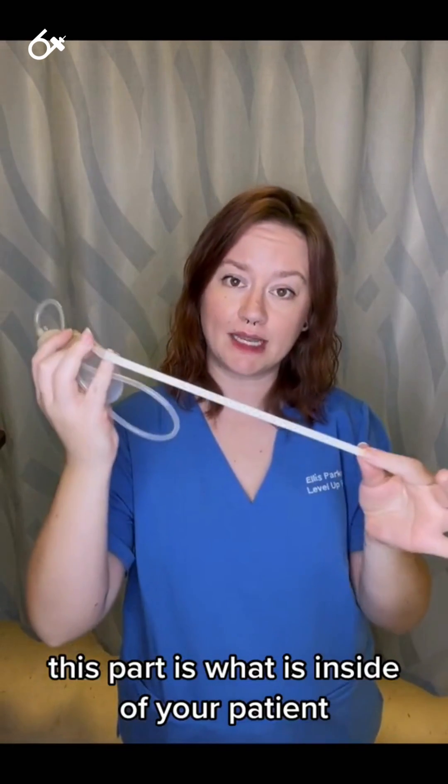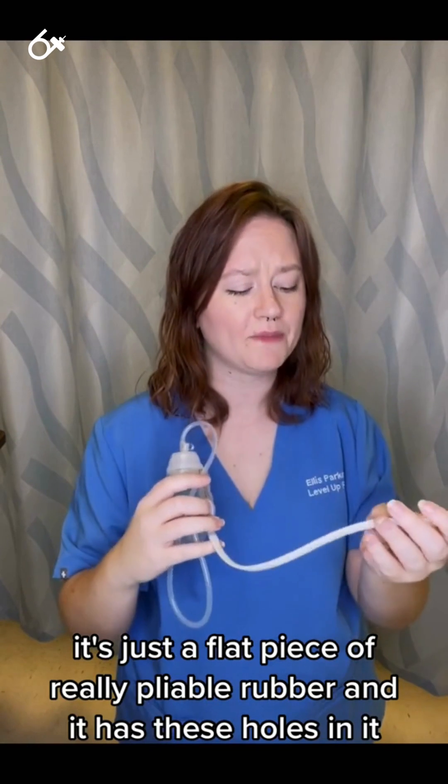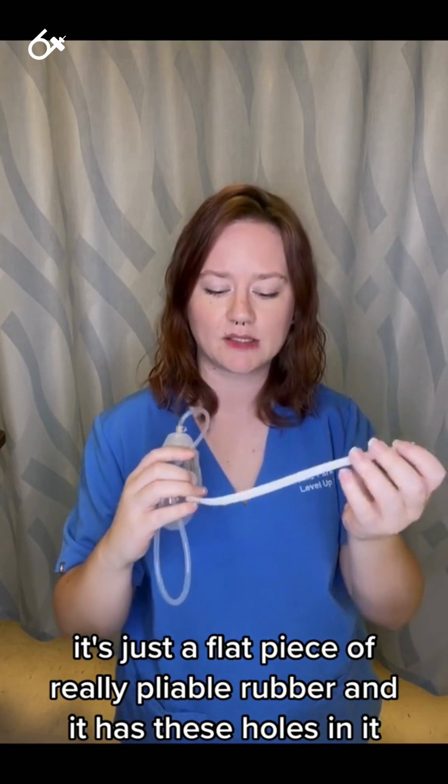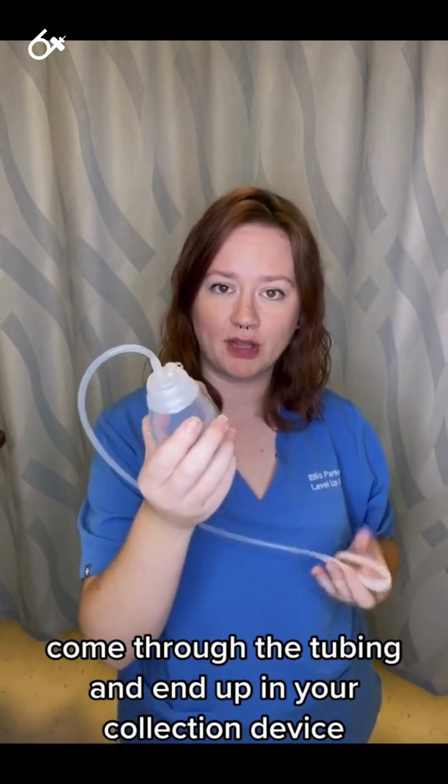This part is what is inside of your patient. It's just a flat piece of really pliable, like rubber, and it has these holes in it so that the drainage can be collected, come through the tubing, and end up in your collection device.